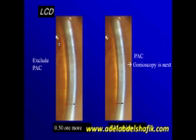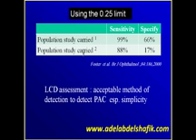So the point is, if you get an angle where the depth here is 1/4 or less, it's an occludable angle and you need to do gonioscopy. If it's more than that, you are safe.